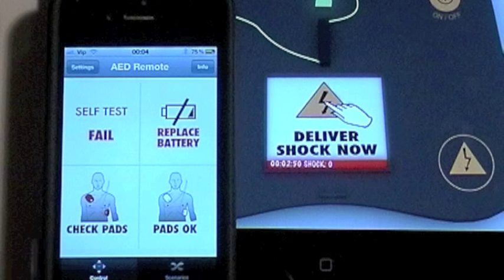At any time during the scenario, you can tap on the Replace Battery button, which will simulate the depleted battery and stop the scenario.